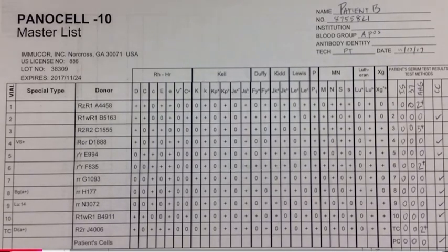So that's good. That's a good way to start out a panel, because if your auto control or your patient cells, which by the way is a combination of patient red blood cells and patient plasma, if that is positive, that pretty much invalidates your panel, because you don't know if any reactions up here are from an allo antibody or from the auto antibody. And remember, auto antibody means an antibody to oneself, and allo antibody is an antibody to a foreign antigen. Okay, so that looks good.